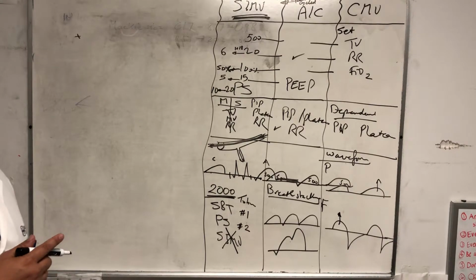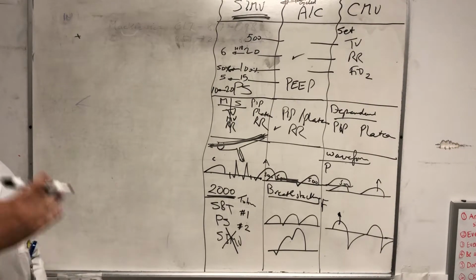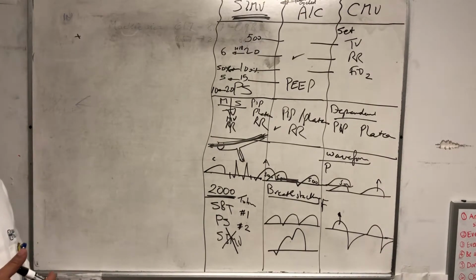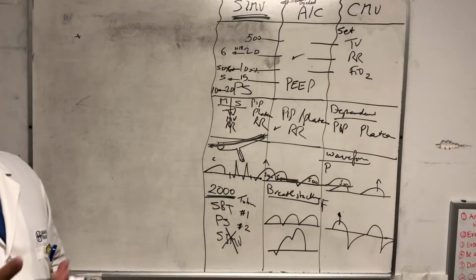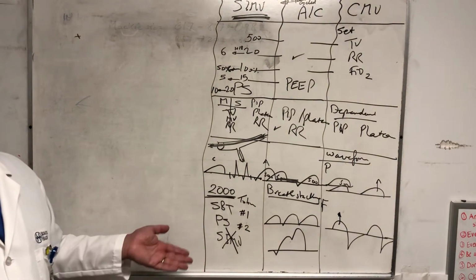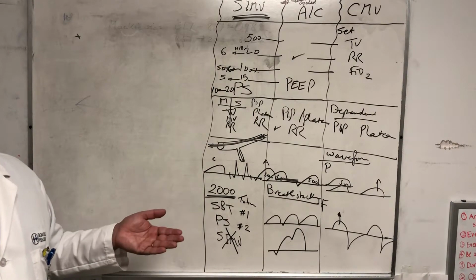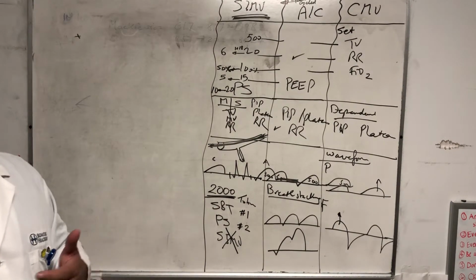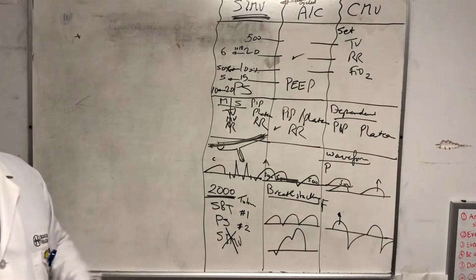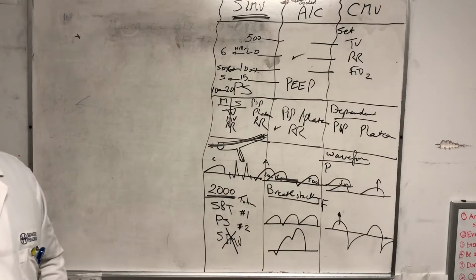If you think about this, it will take about 4 days or so to wean this patient, even though the patient could be ready to be extubated on day 1. But going by the protocol, it takes a long time to wean the patient. And that's what killed the SIMV. That's actually what caused this problem in the study. So that's why nobody uses SIMV in the acute ICU, legitimately at least. The only place some people use it is in rehab places, because time is not an issue there. Just leave them there and let them wean very, very slowly, and it has fewer alarms than pressure support, so why not?